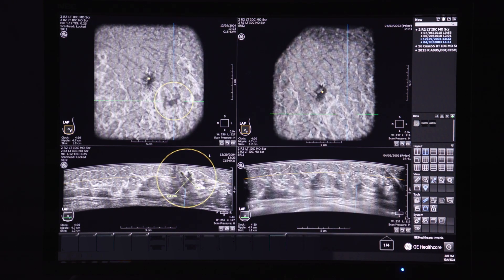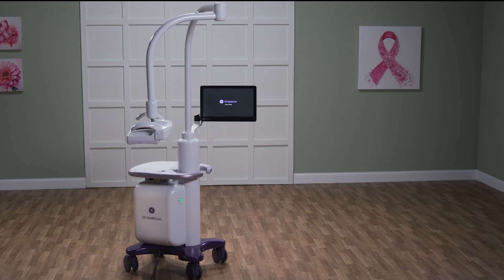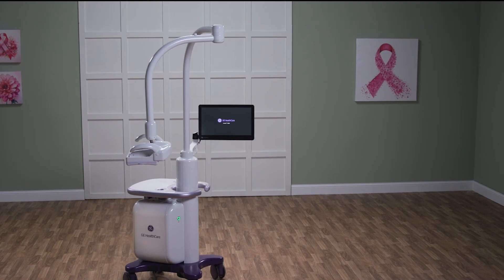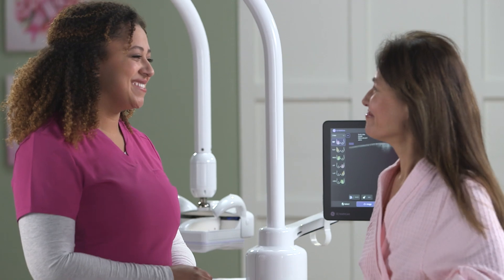The standardized ABUS volumes can serve the entire care pathway, correlating suspicious findings to priors, as well as helping to monitor systematic therapy response and benign lesions in young women. Invenia ABUS Premium — helping physicians to gain peace of mind with optimal outcomes along the care pathway.